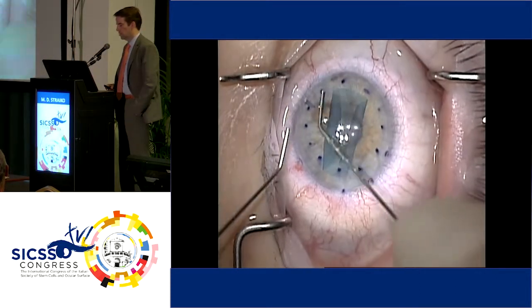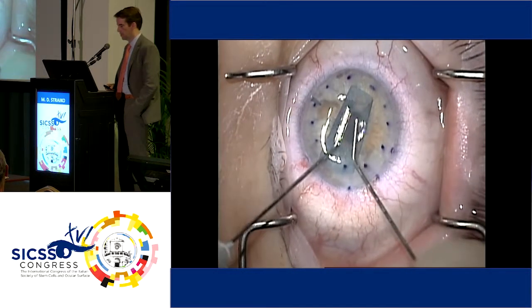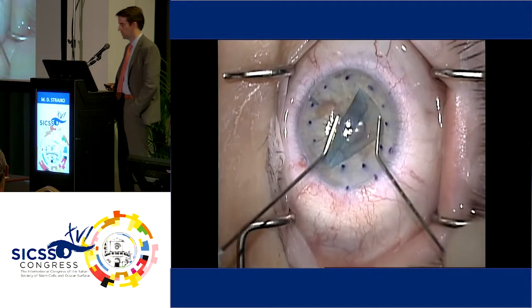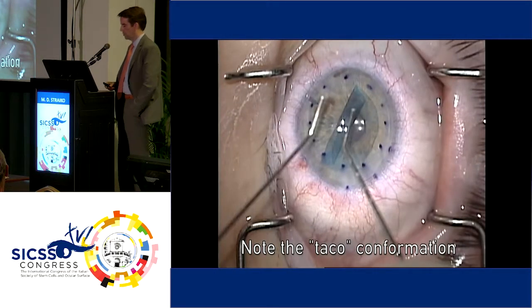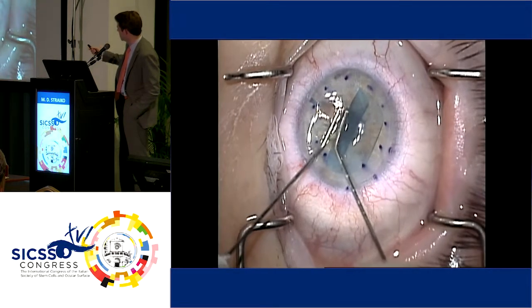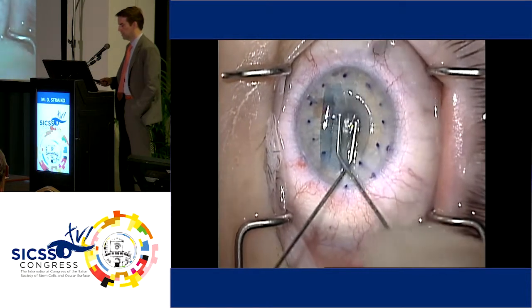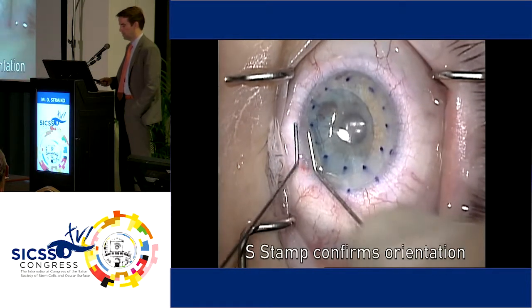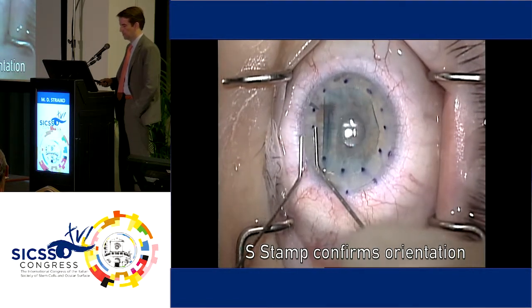And as I'm opening it, I'm also recentering it because I want it to open as centered as possible. So I'm always going back and forth between centering and opening. This graft is opening okay, but now it's in a taco conformation. So I have to stop and think, push with the blue arrow. It relatively deepens where the orange arrow is so it can open. Again, I'm using 2 cannulas to center, pushing with one and tapping with the other, and then centering. And I'll speak a little more to centering in just a bit.